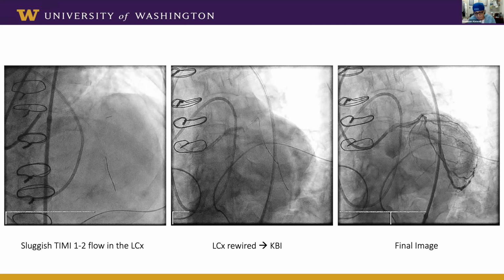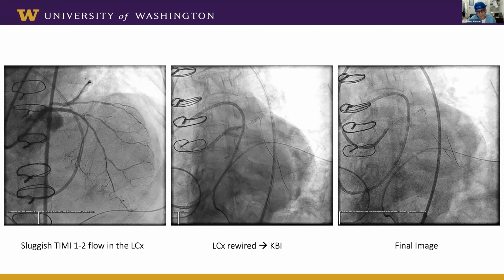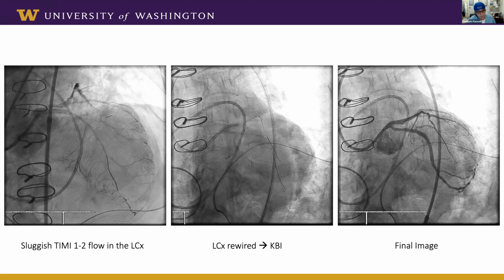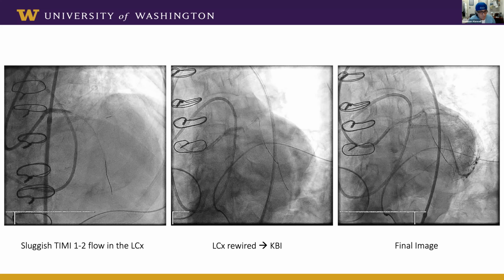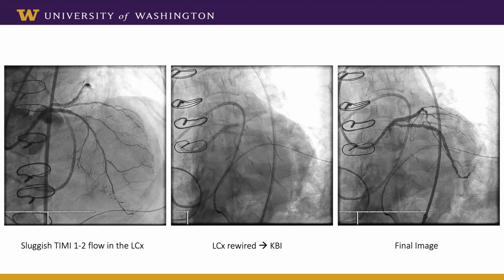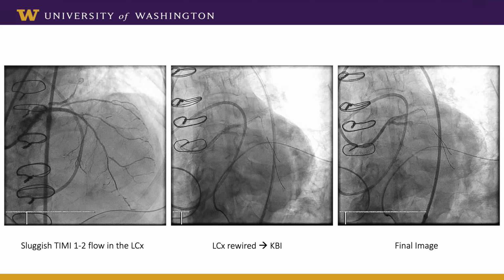I always have something in me that says you have to do a final kiss. The reason is, what if the patient develops STEMI in that circ and there are struts in there, and someone comes in the middle of the night to open that circ, and now they cannot deliver their balloon past my stent? I'm not sure if that's a valid anxiety, but. Yeah, no, it's true. I think you could argue in this case we would have been better off leaving it alone, actually, because there's not a whole lot of reason for a lot of shift otherwise, I don't think.